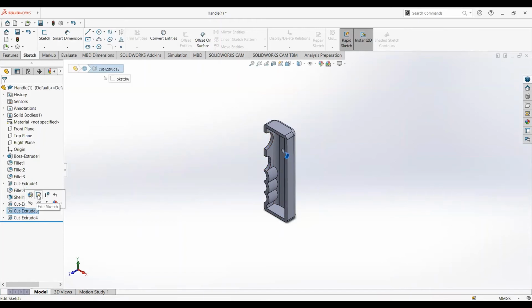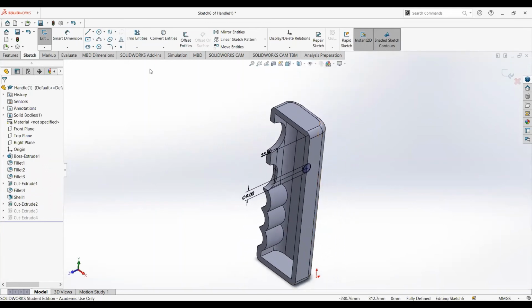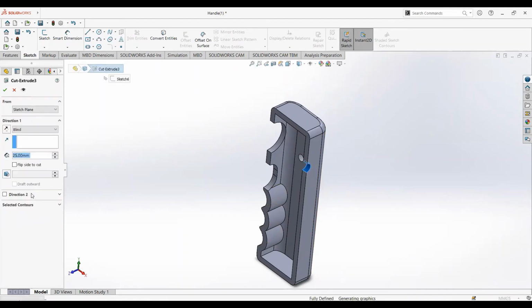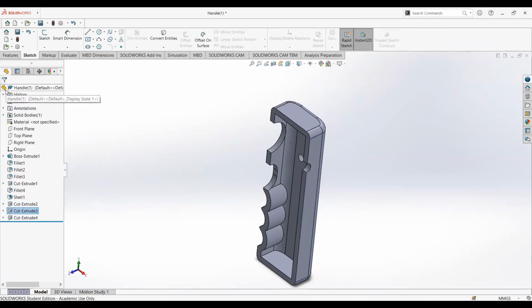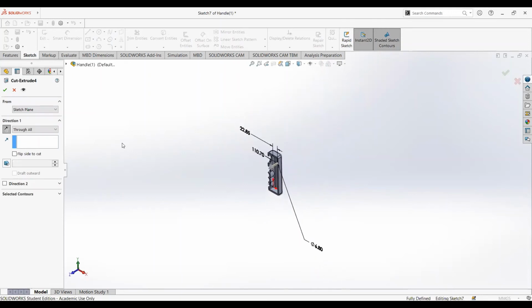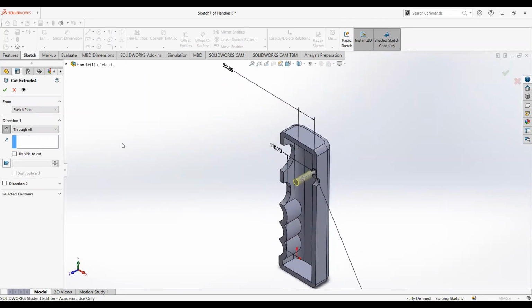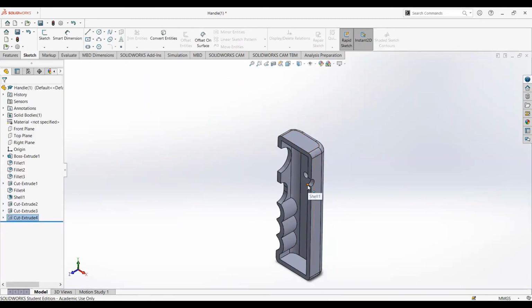And then we sketched this. These are all the dimensions. And we're going to cut extrude that part because we're going to put a screw and a knob right here. At the very end, we sketched and cut extruded this, because at the end, we're going to put a pin through this part. So yeah, this is one of the parts for a shell.